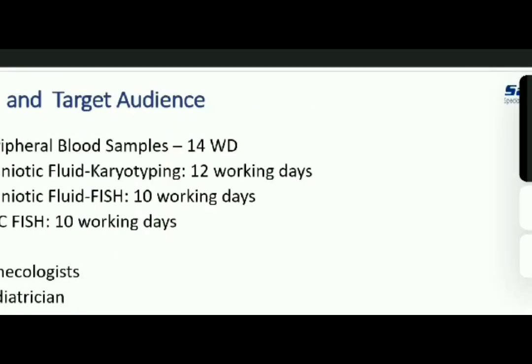And POC karyotyping, I request please don't take POC karyotyping, because many of the time it won't allow us to do proper banding also. Finally, after 21 days, we request the doctor, saying that the sample has failed in culture. So instead of that, I request everyone to go for POC FISH only. Within 10 working days, you'll get the result.